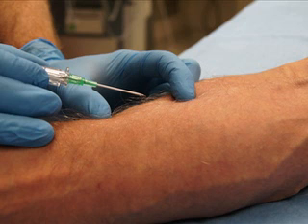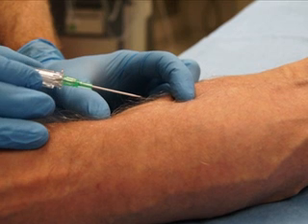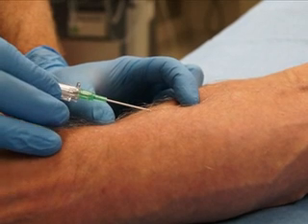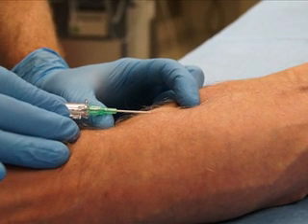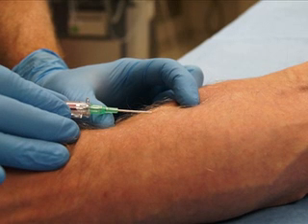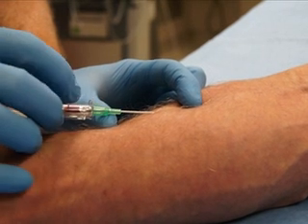The needle approach should be along the course of the vein at an angle of 10 to 30 degrees to the patient's skin. Puncture the skin and then the vein with a quick forward motion so the needle tip penetrates the wall of the vein instead of just pushing it aside. When the needle tip enters the vein, there will be a flash of blood into the catheter. Decrease the angle of the needle and advance 1 to 2 millimeters further to ensure that the entire needle tip and the tip of the catheter are fully within the vessel.